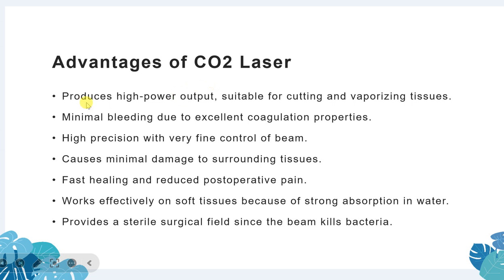Yeah, let me discuss the advantages. Here, the advantages: it produces a high power output suitable for cutting and vaporizing tissues, minimal bleeding due to excellent coagulation properties, high precision with very fine control, causes minimal damage to surrounding tissues, fast healing, and reduced post-operative pain. Okay, because of the lasers only, you can heal fast, and because of the faster healing property, the pain will be reduced, which works effectively on soft tissues because of strong absorption in water.